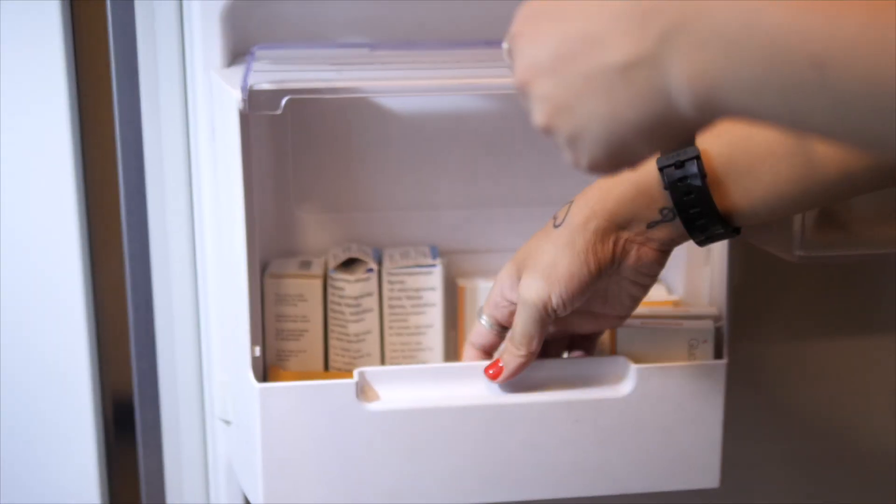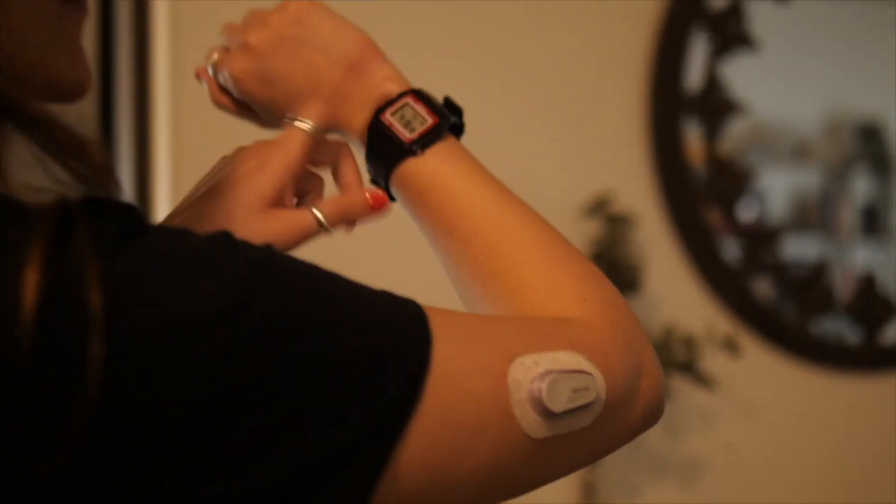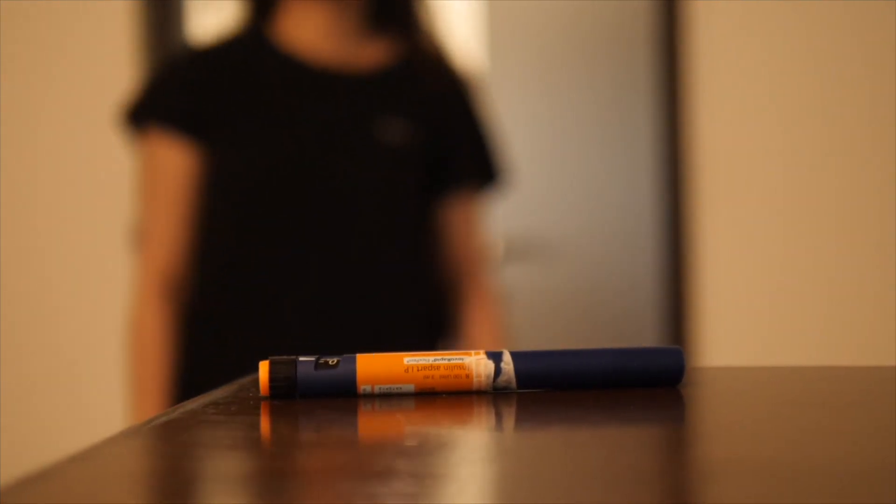Cold insulin stings — trust us. We recommend removing the insulin from the fridge at least 15 minutes prior to injecting. Bring it to room temperature to make the experience far more comfortable.